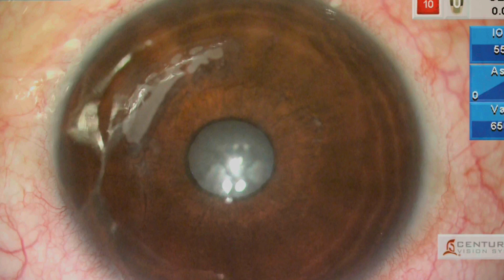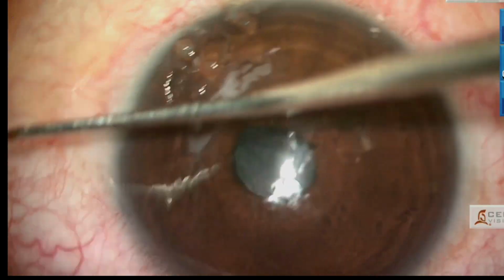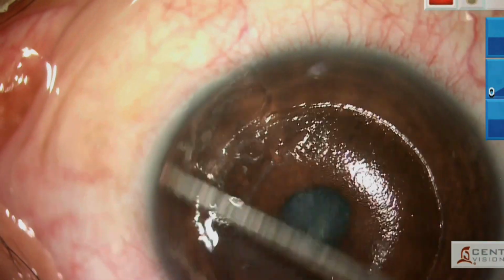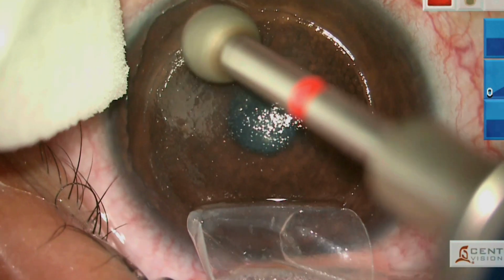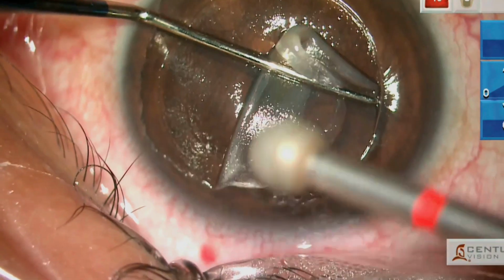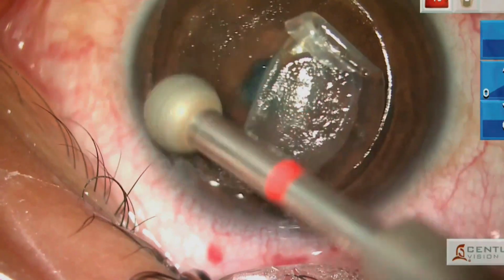Our next patient presented with history of old trauma and complained of severe loss of vision. On examination, there were microstriae with fibrotic epithelial ingrowth. Extent of growth was confirmed on OCT, so we had to lift up the whole flap, wash the pocket of white fluid, and clean the bed and interface with patent spatula. But since the scarring was very dense, diamond burr was used to remove some of the epithelial ingrowths from the interface and the bed. The video has been made short to focus on important steps, but the whole procedure took about 20 to 30 minutes.